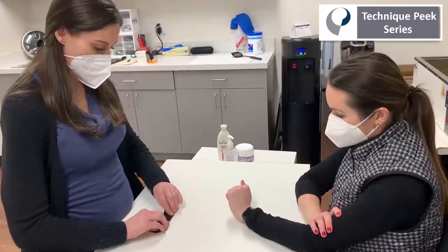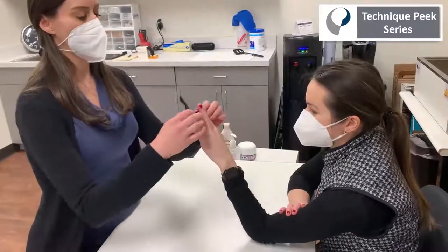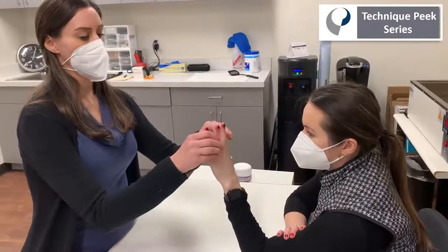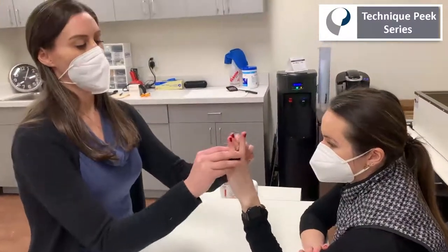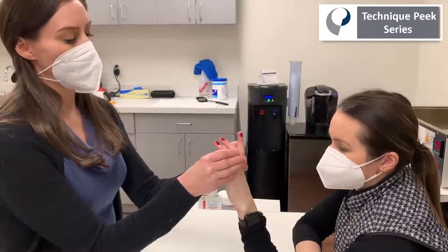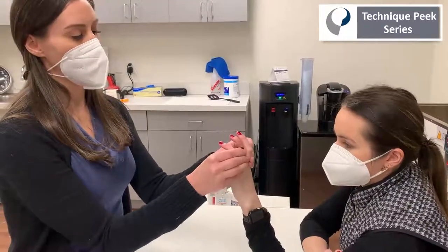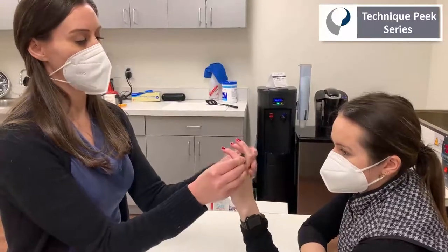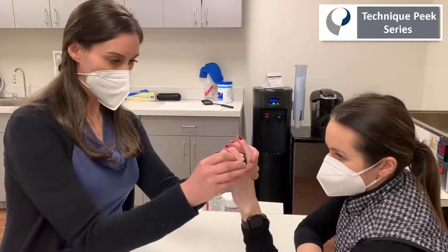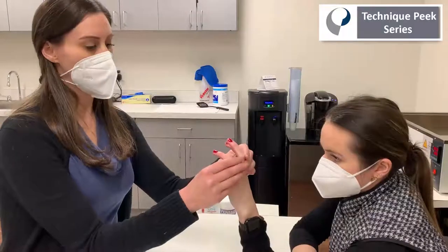I'm going to fold this splint into thirds, then place it under that middle finger and right around the adjacent digits. I'm going to make sure to hold that middle finger in hyperextension in comparison to those adjacent digits. This splint is going to be working on a stiff PIP joint when you're trying to gain flexion. You want to make sure that you're clearing the PIP creases and also that she'll have enough clearance to bend those MPs.